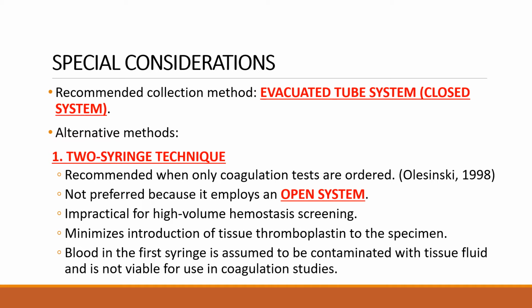What the medical technologist would do is, using the syringe, insert the needle into the arm of the patient, and then if the first syringe is already full with the sample, the medical technologist will have to remove the barrel of the syringe, and he or she should get another empty barrel and attach it to the needle. If you try to imagine it, it's an open system, so it's prone to contamination.